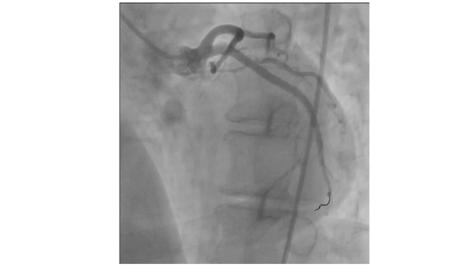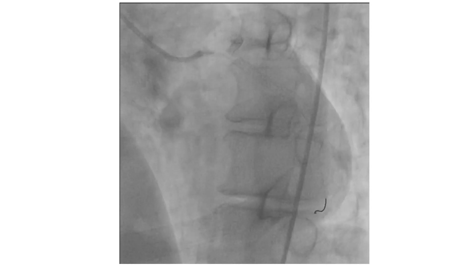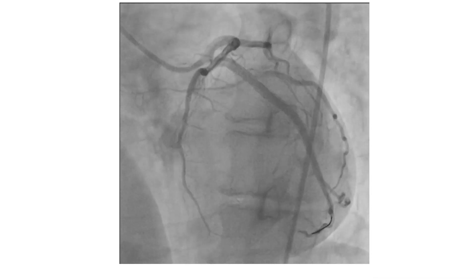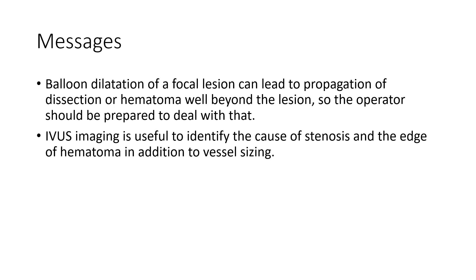Another way to confirm the result is to take an orthogonal view — in this case an RAO view — which shows a good result. The key messages from this case are: balloon dilatation of a focal lesion can lead to propagation of dissection or hematoma distal to the lesion, so the operator should be prepared to deal with that. IVUS imaging is useful to identify the cause of stenosis and the edge of the hematoma, in addition to vessel sizing. Thank you.